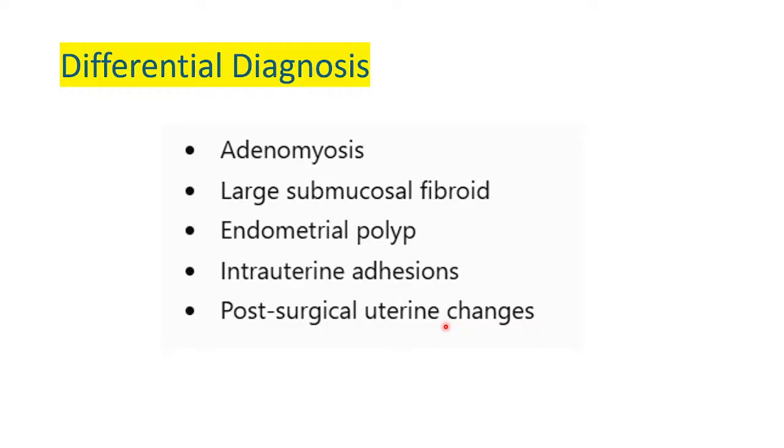So, ladies and gentlemen, this brings us to the end of this presentation on congenital uterine anomalies. I need you to appreciate these and add them to your vocabulary of pathologies, so that when you're doing a pelvic ultrasound scan, you must be on the lookout for congenital anomalies. Otherwise, you might miss a great finding that could be troubling a couple for years trying to get pregnant yet failing.